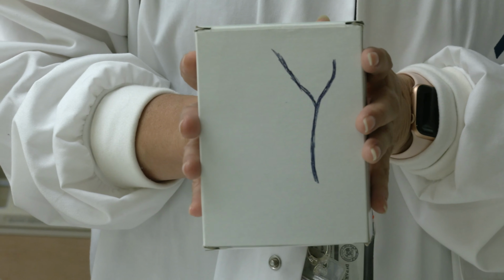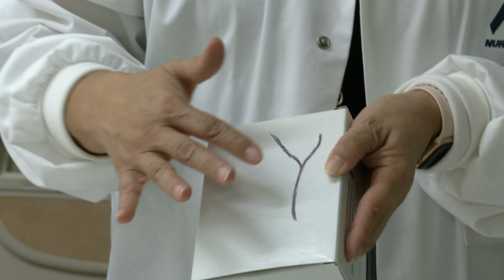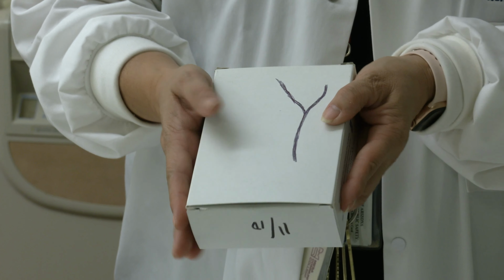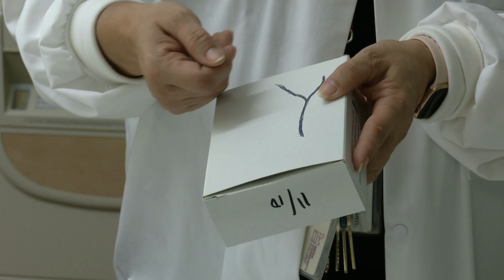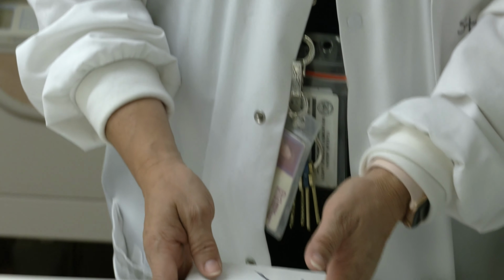All right, I have made my very own IV arm, and that's what I want you guys to do at home: find some box that you can use in order to insert your needle and get a feel of how you're going to have to move it around.